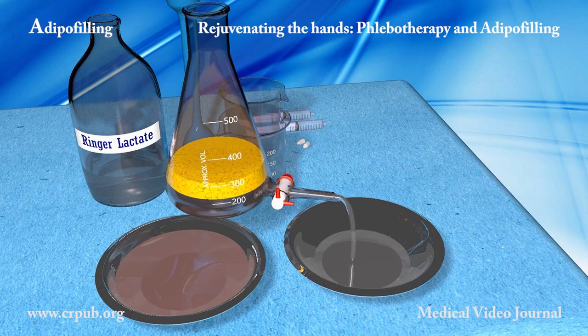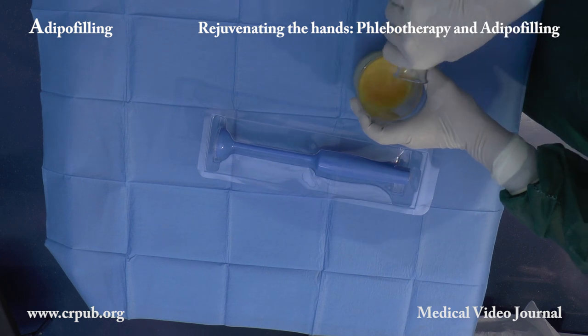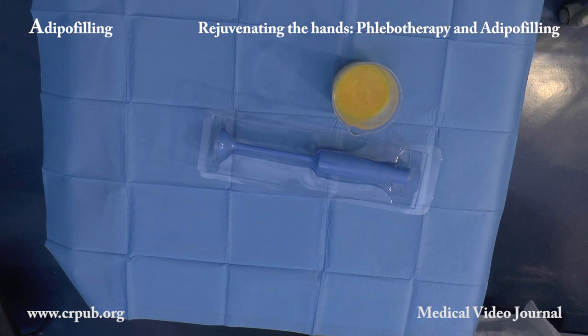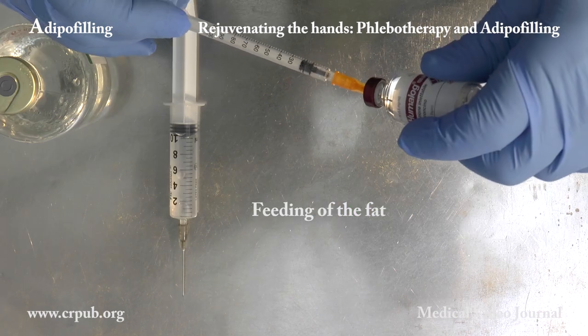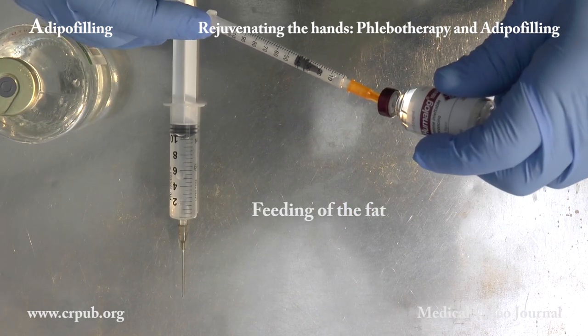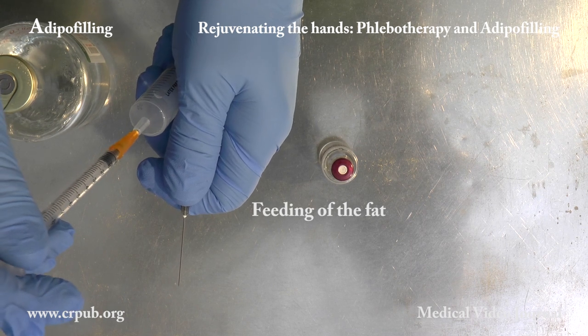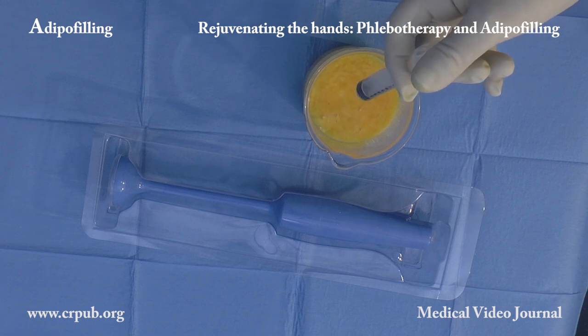The washed lobular fat is then placed in a beaker together with a one-third volume of Ringer solution or physiological solution. We now aspirate 10ml of a 5% glucose solution to which we add 30 international units of rapid insulin. The solution with the insulin is added to the fragmentation liquid.